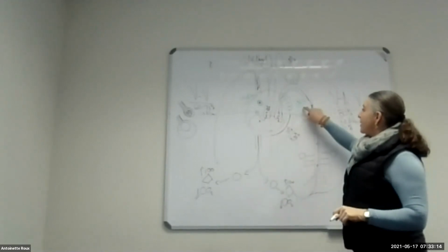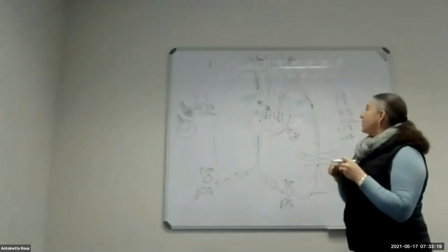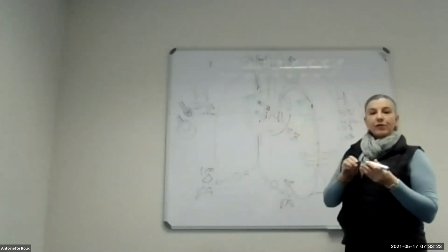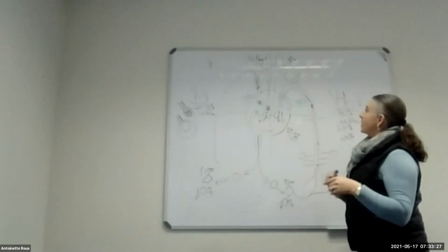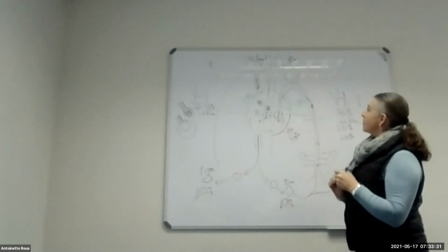Okay, so your SAO2 will be measured on your probe on your finger, and you will see that on the monitor. The SVO2 you will be able to see on the venous gases, or on our machine it will be displayed 24/7, so you can see what you're busy with.